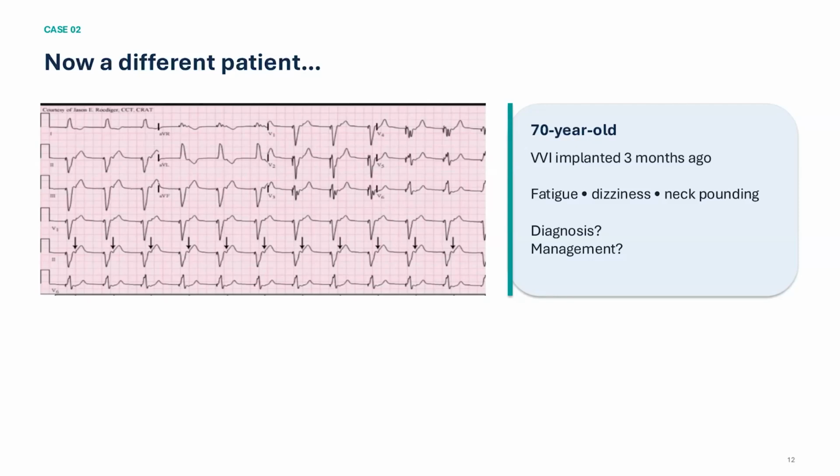This patient will have a dramatic response when you just change the mode from VVI to DDD, as the patient has retrograde P and a sinus rhythm. So you just change the mode from VVI to DDD. The patient will hug you and kiss you, that you changed his life.